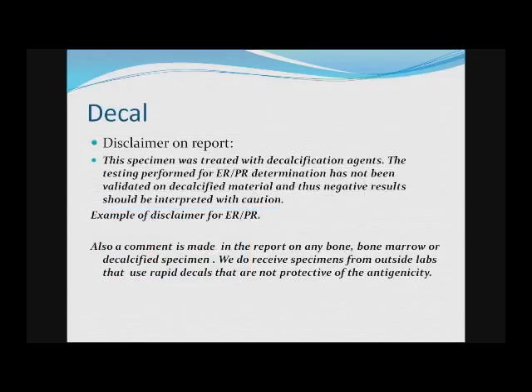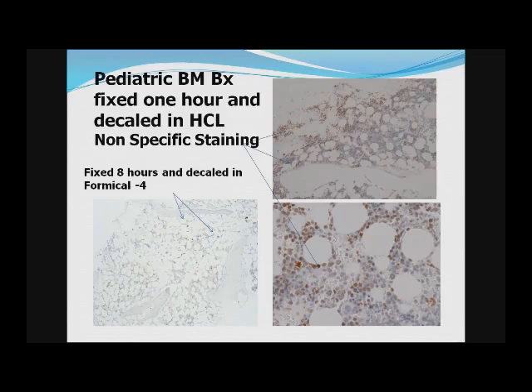Now, also, if you're working with decal material, you do need a disclaimer unless you have validated your testing. Here's an example of a pediatric bone marrow that was fixed for 1 hour and decaled in HCl, and they needed an in situ hybridization, and the HCl did so much damage to the specimen that this biopsy had to be repeated, which is not what any of us want to ever have happen on a pediatric case.